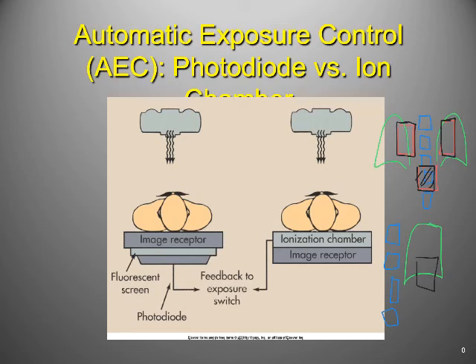So I say all that to say we will get more into the nitty-gritty of how the automatic exposure control works. I want you to recognize it's a major part of how x-rays are produced now, and it does have some special considerations with it. So we'll look at some of those and talk about them some in the lab. I'll make sure everyone gets a chance to think about that as Mr. Wolf is doing procedures, because that's going to be the best way to see how that plays out.